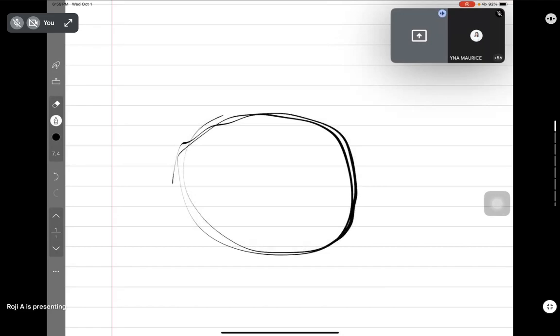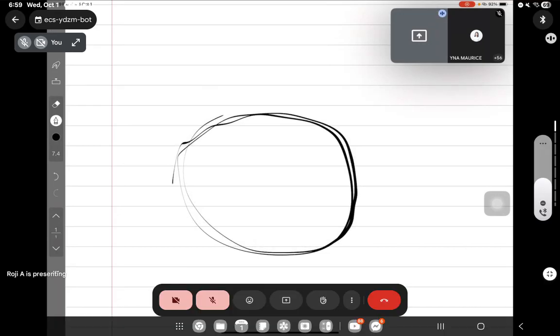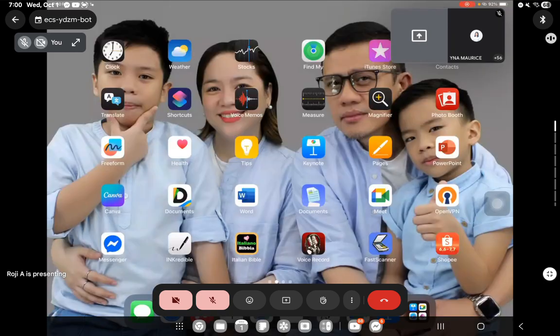Have you tried that, like the one you put in the car, you stick it on the window or the glass, and it sucks. Have you done that to your face? When I was young, I used to do that. When I stick it to my face, it leaves a mark. That mark is called indentation. Are you clear with indentation? Yes, Doc. Okay, Zach, thank you.